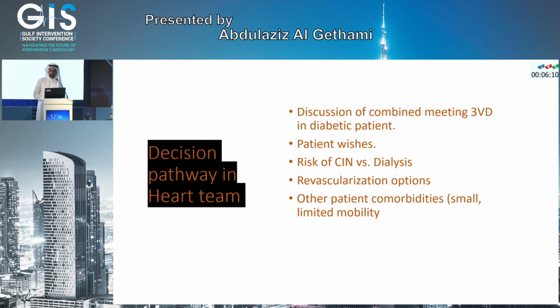Well, first of all, I think it's always a mistake not to do a coronary angiogram when you have a non-STEMI. You have to consider the creatinine, you have to reduce the amount of contrast, but doing the diagnostic angiogram, 2 views of the left, 1 view of the right, 15 ml of contrast will not send the patient to dialysis anyway. And then you can do the procedure, as Gabriele said, basically without contrast.